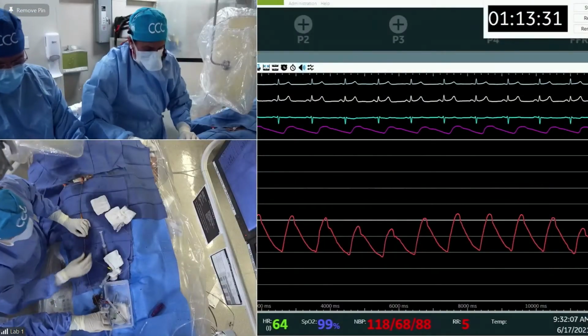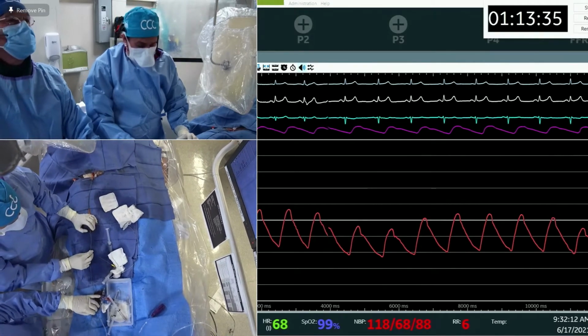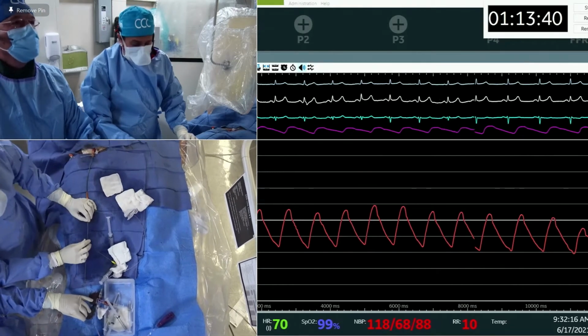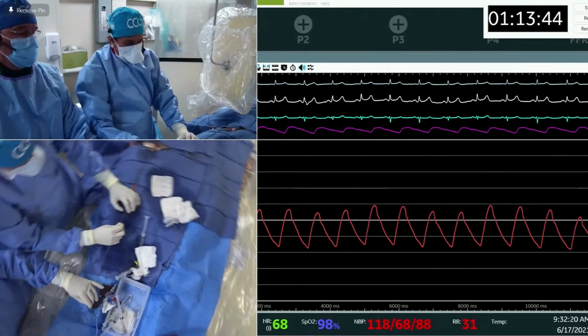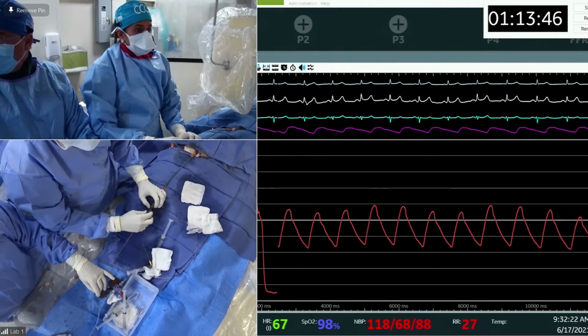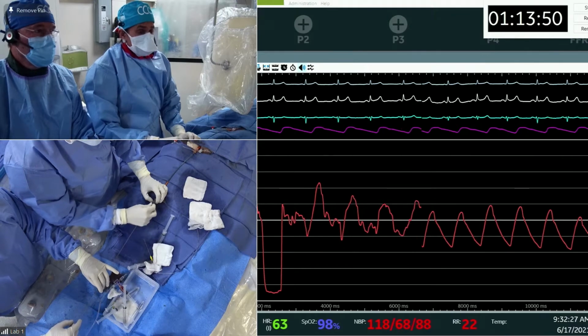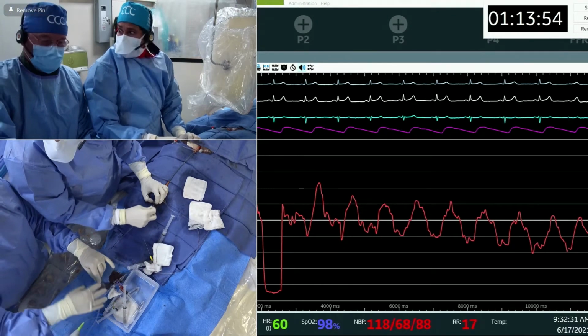Orbital actually does a little bit better with some of it. Rotablator, of course, will gutter if it has a severe bias, right? So it won't go through the lumen that you see. It creates its own lumen when it has a severe angulation because it is spinning at a much higher speed and has a lot more power. Orbital kind of will adjust a little bit more and accommodate those bends, so it actually does a little bit better, I think, in those situations. Yeah. This is a perfect one for orbital.